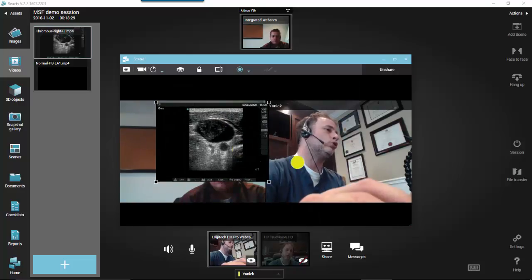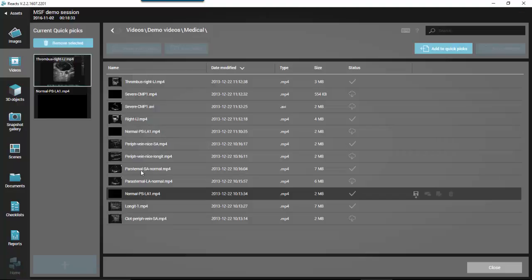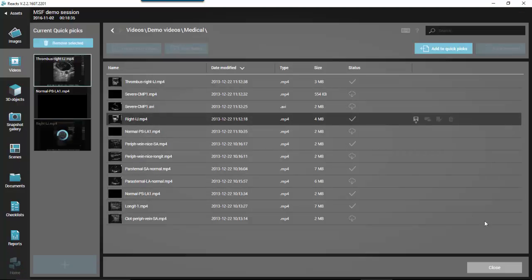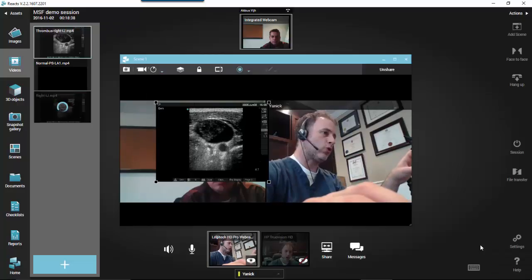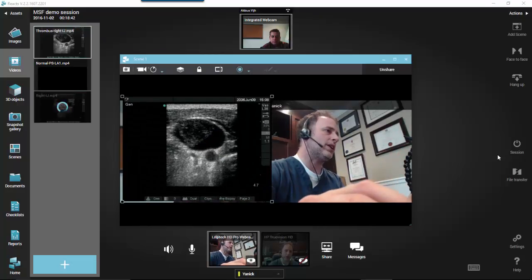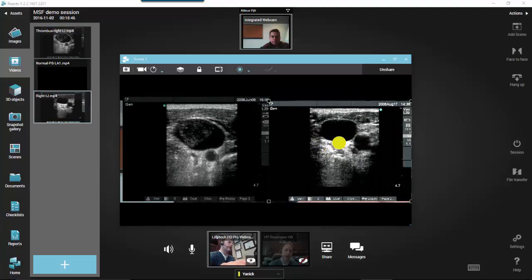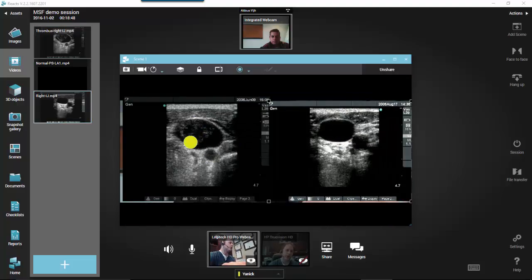If I would like to show him a normal clip, just so that he can compare, I would go to my videos. Here I have a normal right IJ. Okay, drag and drop in my quick picks. As soon as the encryption is done and it's ready, I take it and put it right beside, and now I can show him, here's the normal IJ, here's the one with the big clot. So we can record this, take a snapshot.